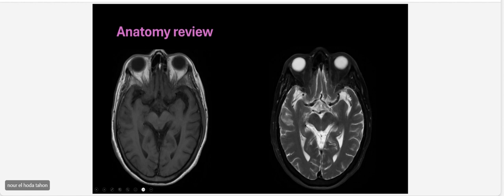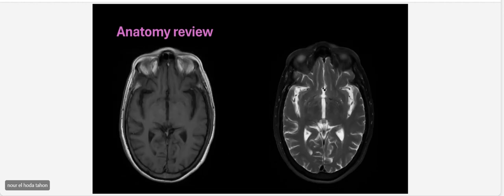Again here, the sylvian fissure and the temporal lobe, the occipital lobe here, right and left, and as we said, this starts to show the frontal lobe here. On the other side, here is the inferior frontal lobe, the orbital gyrus, and the gyrus rectus is here. And again, the left temporal lobe starts to end, and the sylvian fissure is wider because the middle cerebral artery is giving some sylvian branches here, right and left.